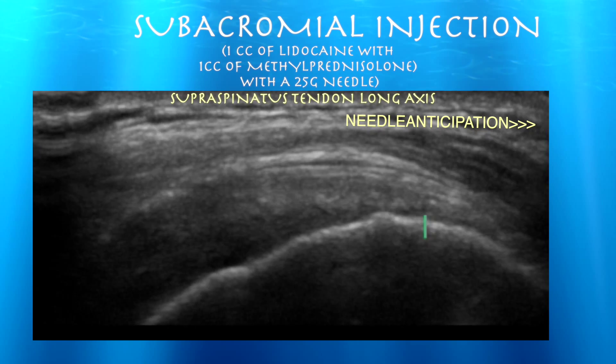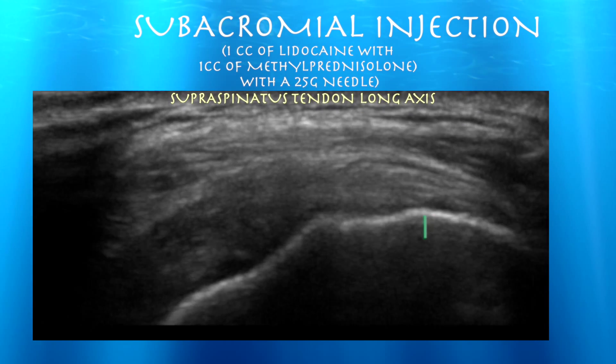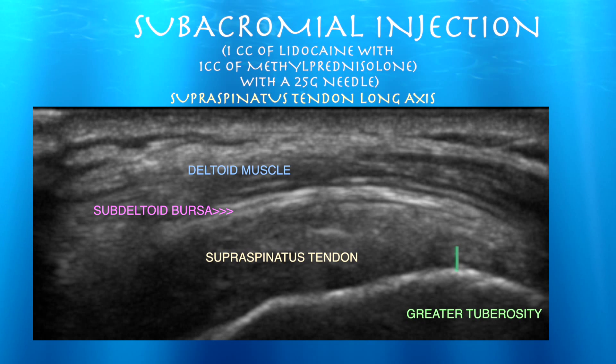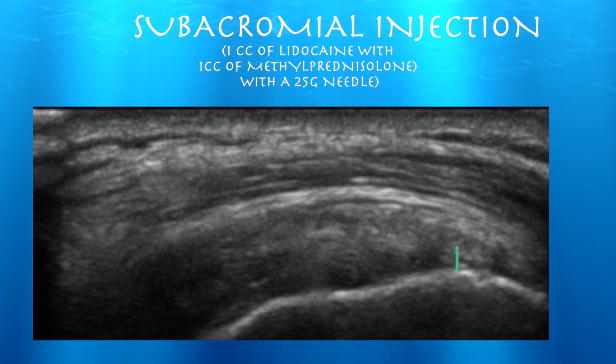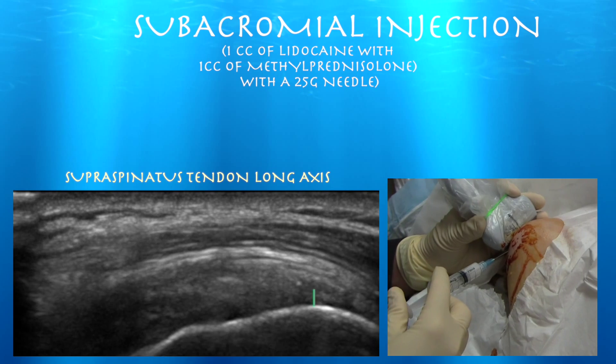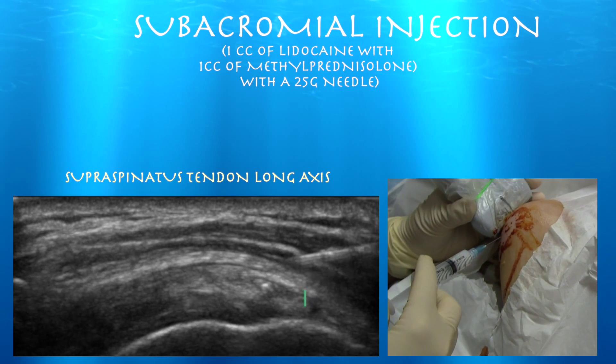We're anticipating this injection — the needle probe is in the upper right corner of the screen. The structures are the subdeltoid bursa, deltoid muscle, and supraspinatus tendon, all relatively normal looking on ultrasound. We're going to feed the needle into the subdeltoid bursa, and here you can see the needle coming in on the right side of the screen.